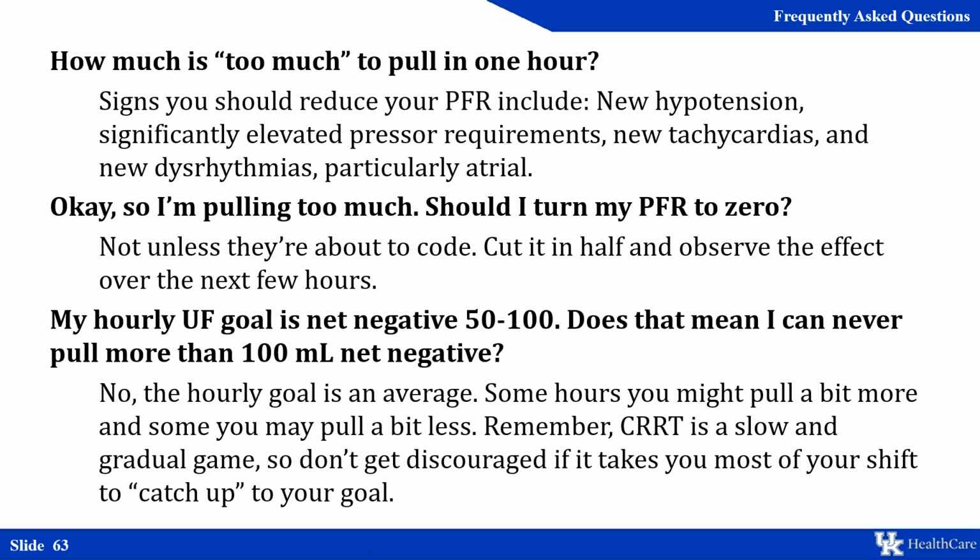That means some hours you may be able to pull a little bit more, and some hours you may pull a little bit less. Remember, CRRT is slow and gradual, and this is everything that we do. We want you to make sure that you're being safe and not getting discouraged if you can't quite catch up.